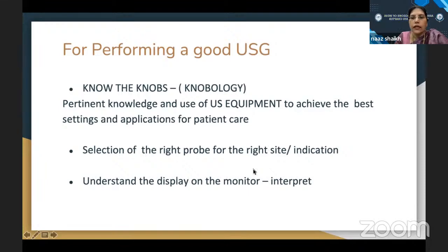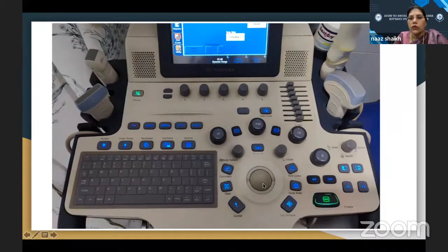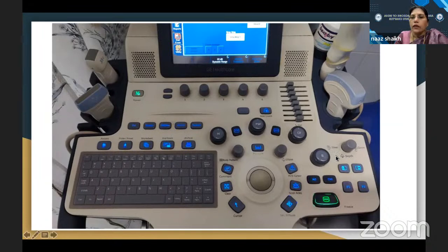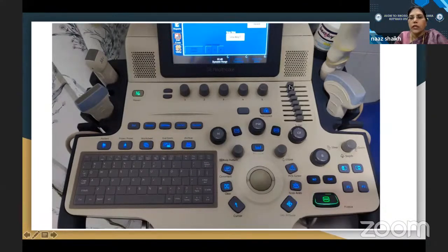Looking at the control panel: this is the trackball to move the transducer, there is a freeze button, calipers to take measurements. The B mode button adjusts brightness. There is color flow, power Doppler, pulse wave Doppler, continuous wave, and M mode. A zoom button also adjusts depth. There is the time gain compensation, which is important. Coming to depth adjustment: there is often wasted ultrasound real estate on screen, so adjusting the depth to fill the whole screen gives a better image.